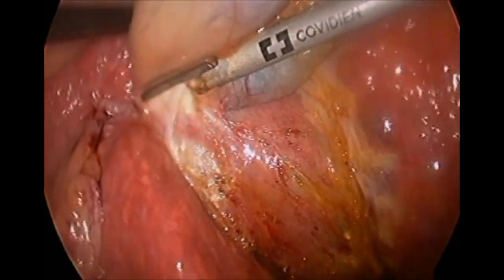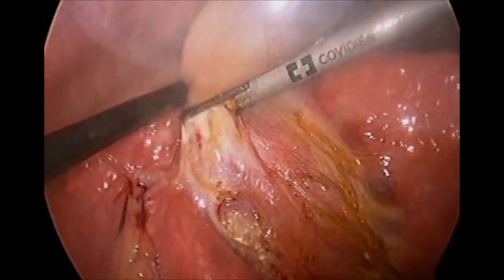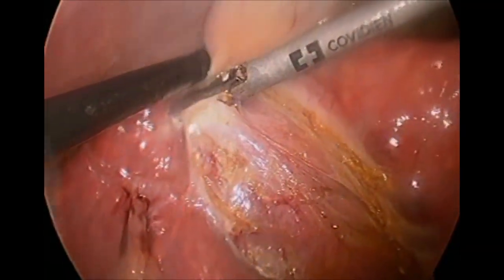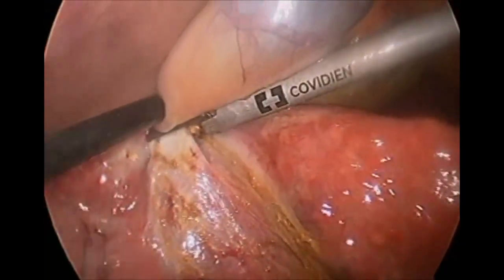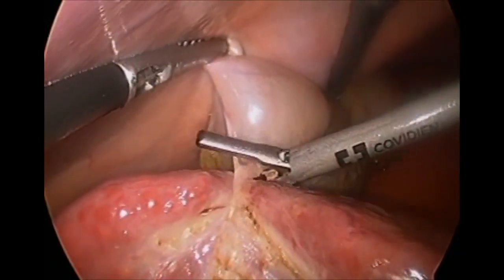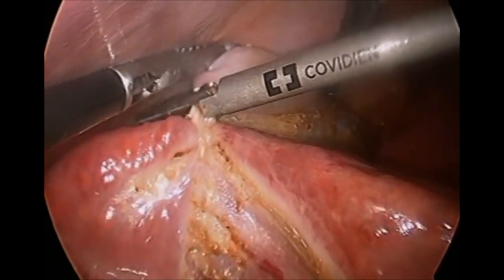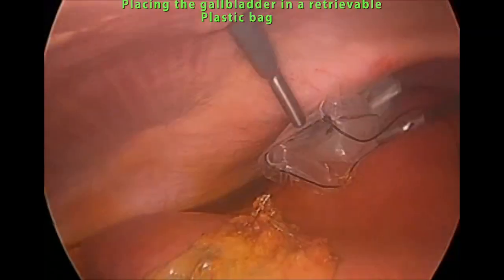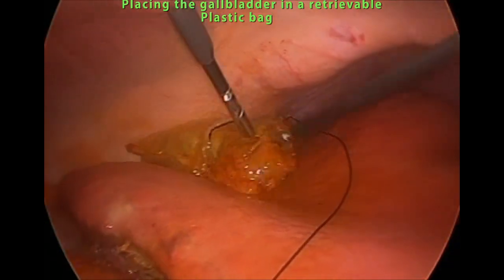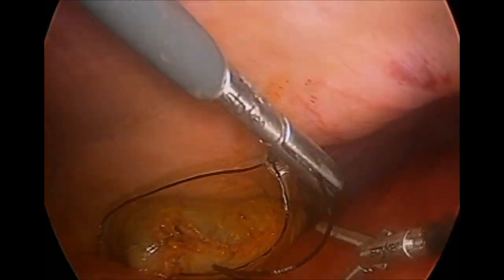Again, it's very important here to notice that the bleeding is well controlled, especially on these cirrhotic patients. So that's a good advantage of using the ultrasonic dissector. Now we're going to take the gallbladder off completely of the liver. We're going to place it in a retrievable plastic bag. Then we're going to check for the bleeding control.